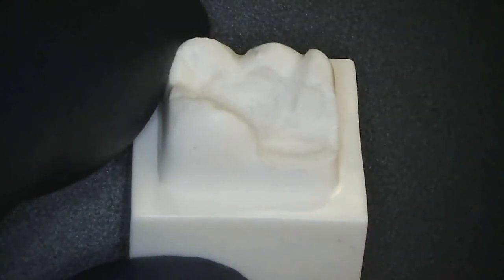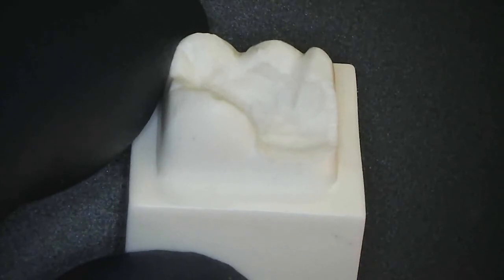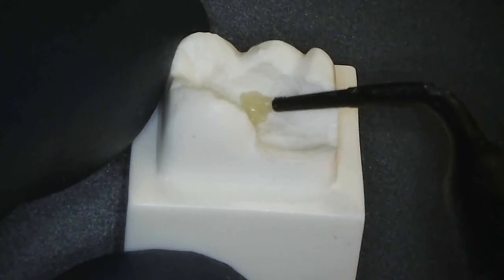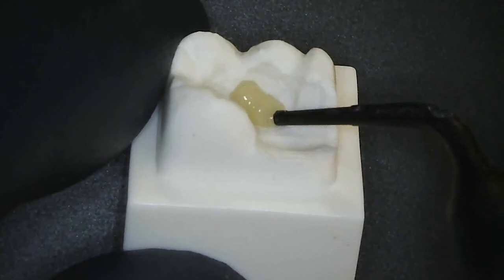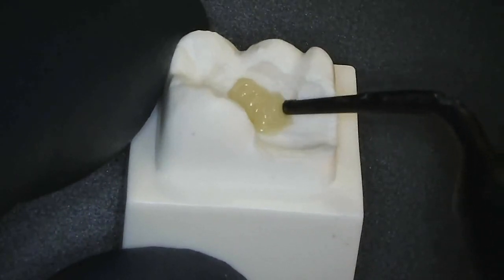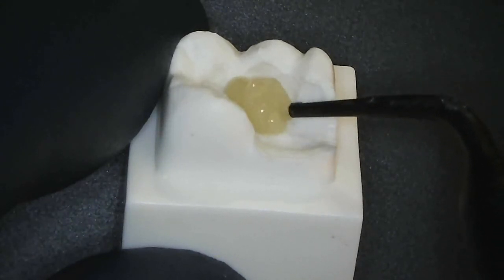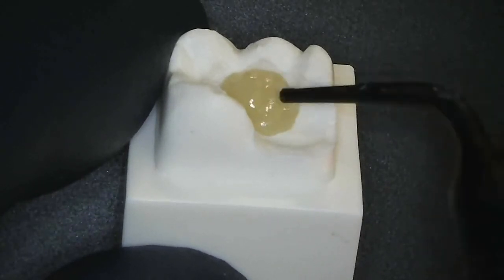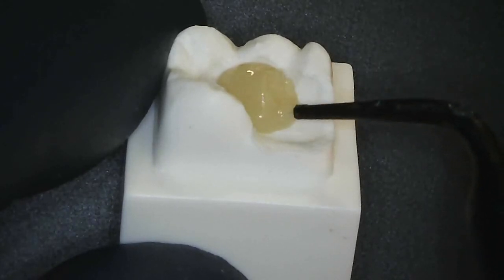The last thing I'd like to show you is a product that can be used as dentin replacement and core material under large composites — this is Everex Flow. It's a glass-reinforced composite and tremendously strong. This is the dentin shade, and here I'm building up the internal aspect, replacing the dentin of a tooth that will eventually get a crown or a large composite. You can also see the stackability.